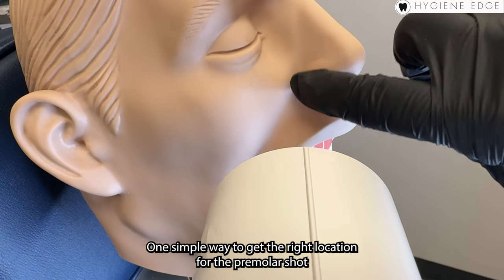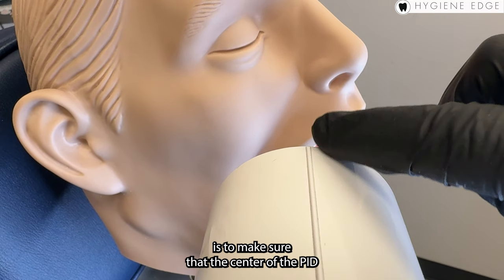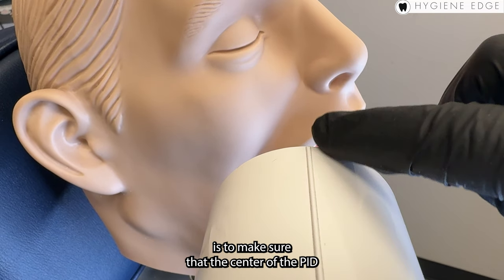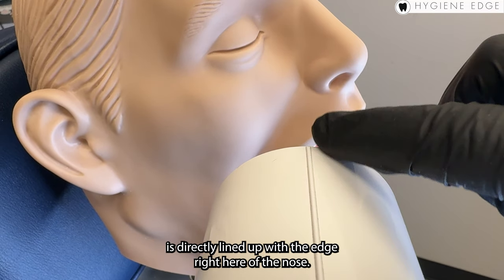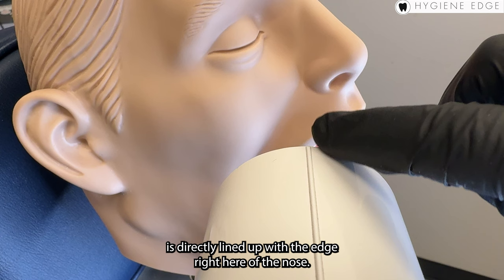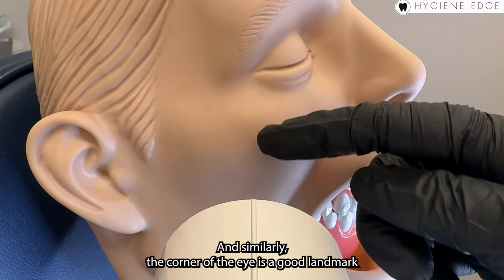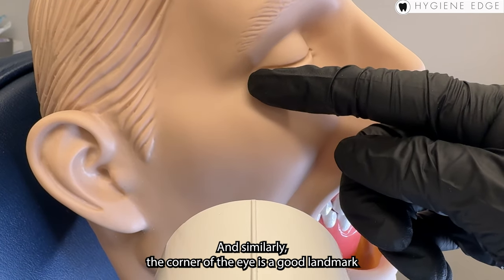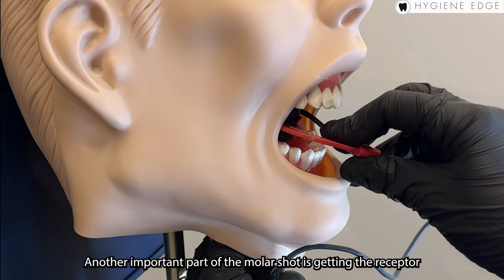One simple way to get the right location for the premolar shot is to make sure that the center of the PID is directly lined up with the edge of the nose right here. Similarly, the corner of the eye is a good landmark to line up the center of the PID for the molar shot.